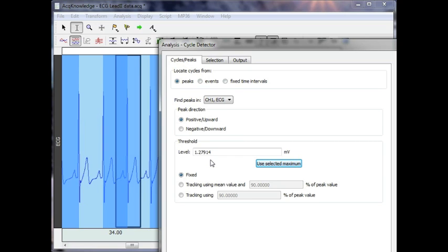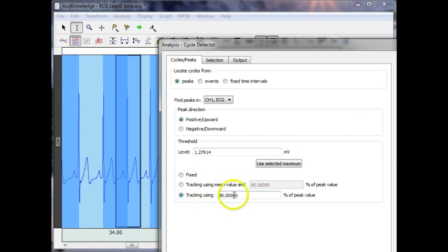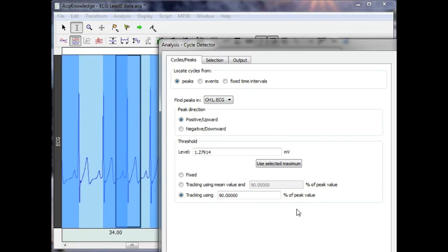You can also use tracking modes. The easiest and simplest is to set a percentage of the peak value. So if the peak value is 2 millivolts, the threshold for the next event will be set at 90% of the 2 millivolts.